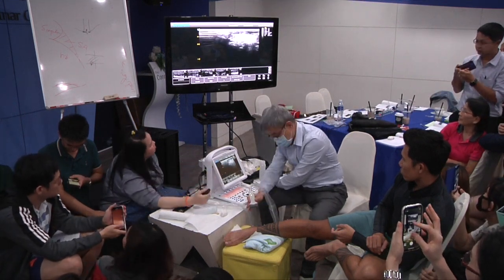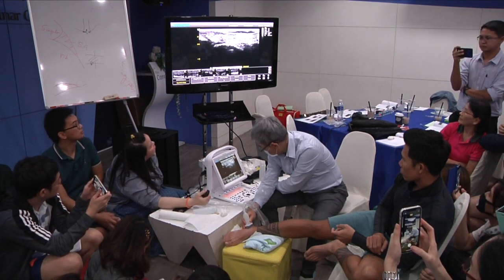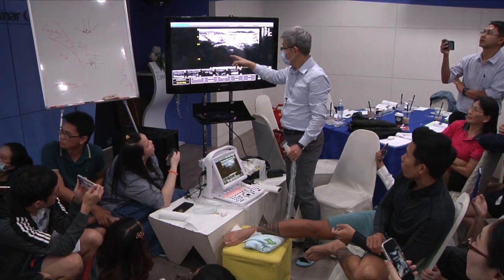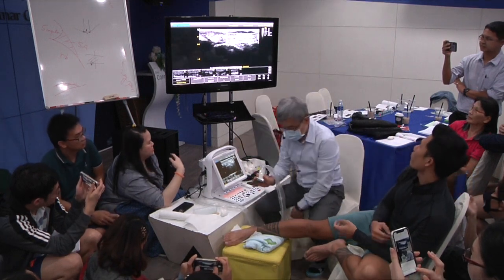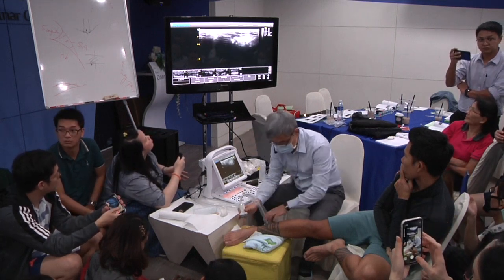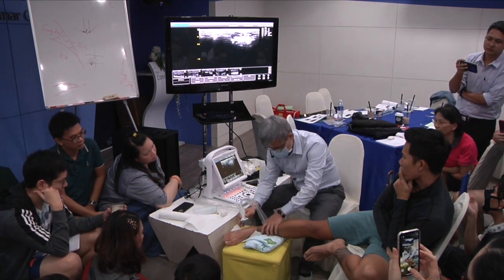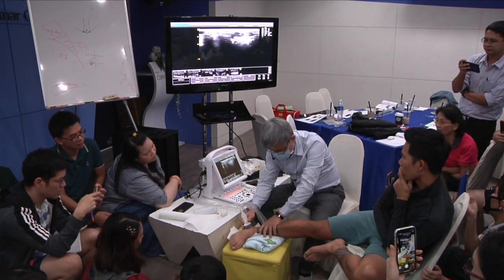Okay. Ooh. Easy, don't worry. Slightly brighter, right? Slightly brighter. ATFL. Okay, one more. And I'm going to move to another. Lateral malleolus. Fourth toe. Slightly dorsiflexed, plantarflexed.